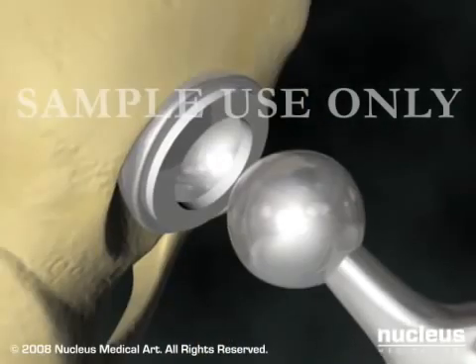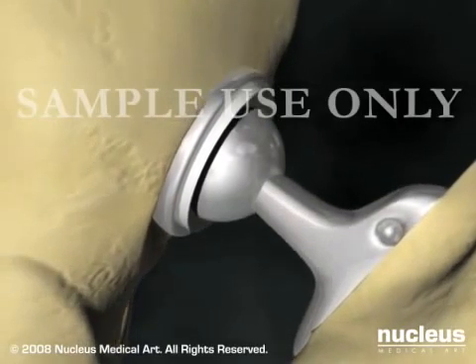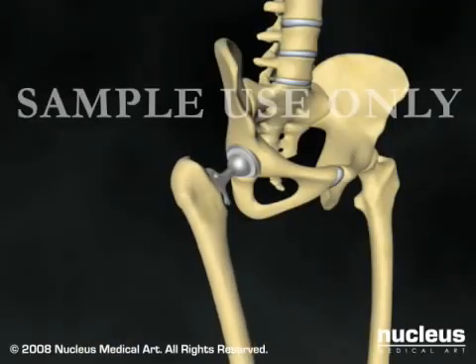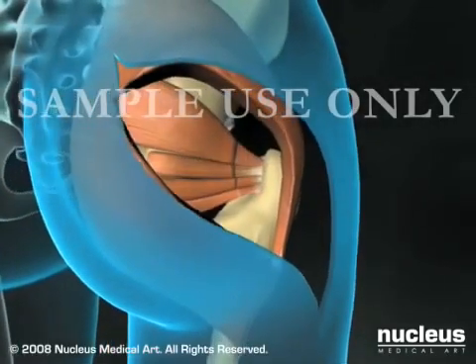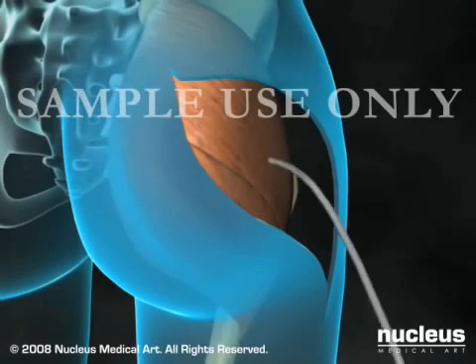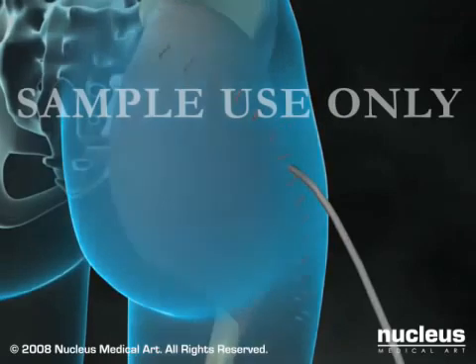Once both components are firmly in place, your surgeon will slide the prosthetic femoral head into its acetabular counterpart, test the movement of your new hip joint, and verify that it is properly positioned with an X-ray. Your surgeon will then close the joint capsule, repair the muscles, place a drain in your hip to remove excess fluid, and close the incision with stitches or staples.